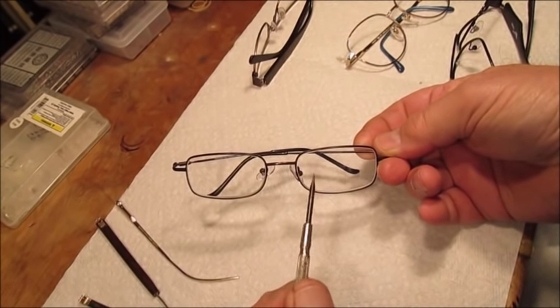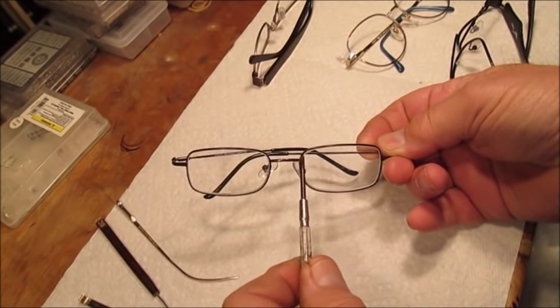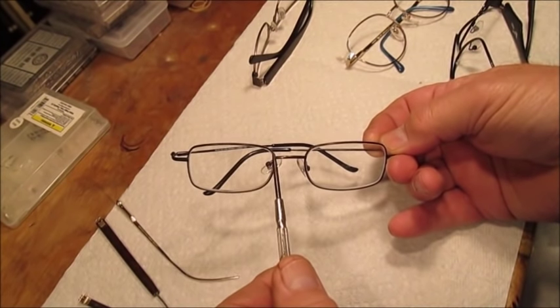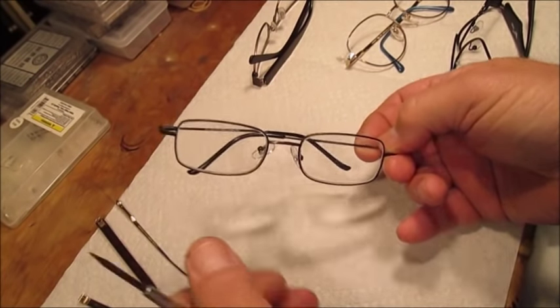Typically the weld at the nose bridge going into the channel material surrounding the lenses is one of the spots that very commonly breaks. This can be as the result of fatigue or the result of adjusting the glasses.